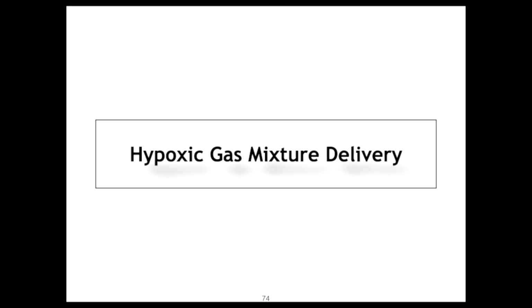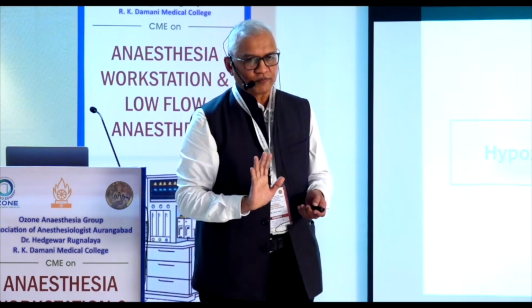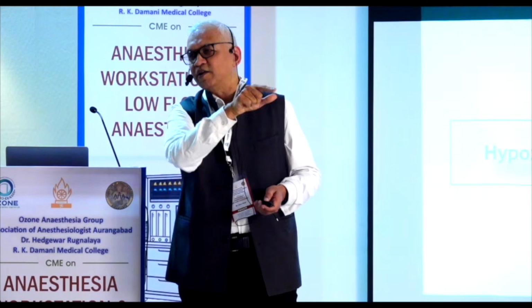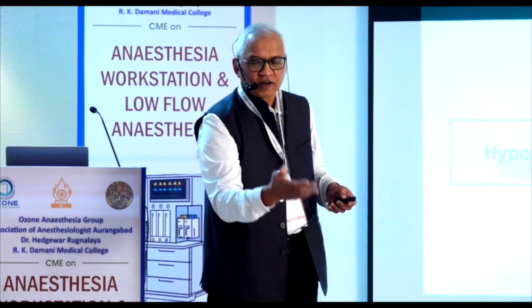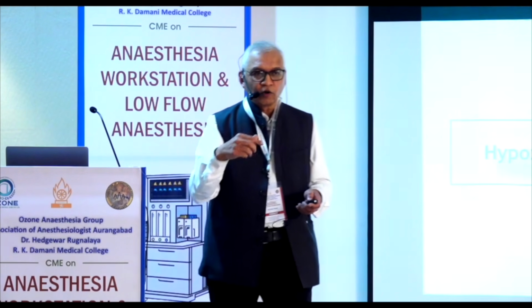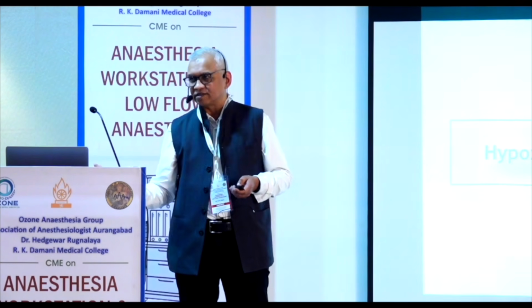In fact, if you have this machine, Draeger Fabius, tomorrow you just try to start the DES compensation on. Routinely it is off. The moment you make it on, the tidal volume value which you are getting will be different. You are ventilating the same patient. Suppose you are delivering 400, it might show you a different value immediately in the next breath, because you have made DES compensation on, and now the machine identified that you have started using DES.